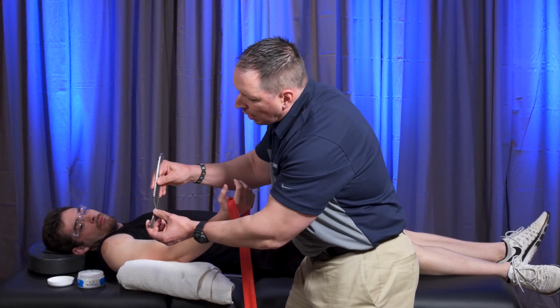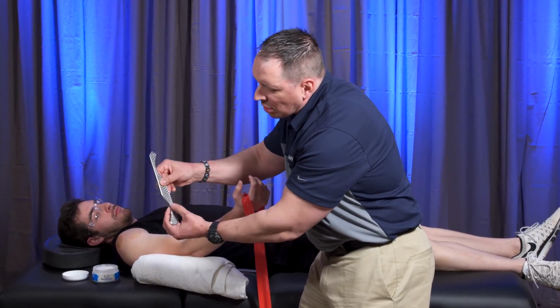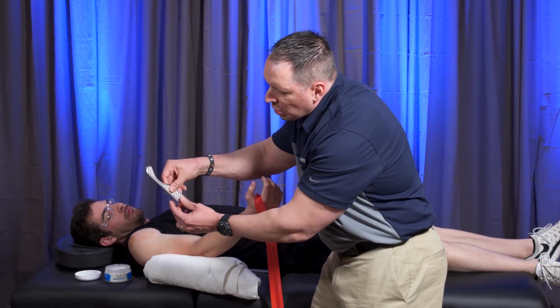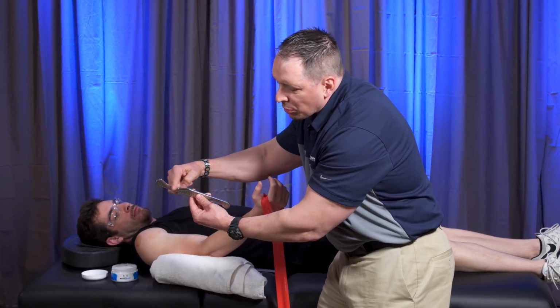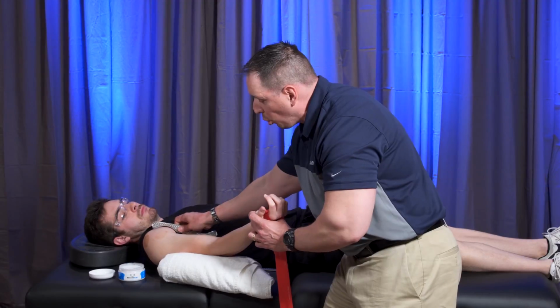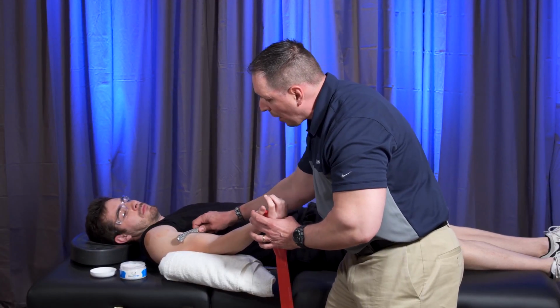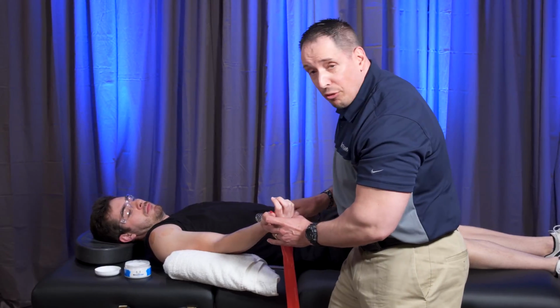As we can see with this big bottle opener here, we have a double beveled edge, which is going to be a softer, more comfortable treatment edge. And then we can get down a little deeper with a single beveled edge. And we're going to work really from this whole kinetic chain, from the shoulder right down from the deltopectoral interval, right down to the distal and proximal biceps. And I can work right down into the forearm.